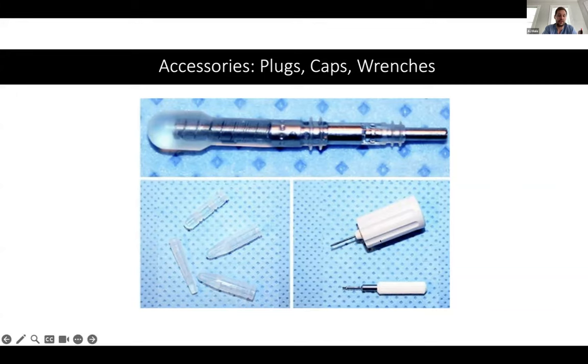And then obviously hex wrenches, always keep some extra hex wrenches ready to go. Reprocessed devices will not have hex wrenches waiting for you. So if you don't have one, you're going to have a can and no way to connect it. So I recommend always having these. I don't have it listed, but I always recommend having suture sleeves and medical adhesive as well. It is a great way to make a makeshift lead repair kit. If you're doing a generator change and there's damage to the lead, or you inadvertently nick the insulation, you can put glue around it, put the suture sleeve around it, and then tie it down with sutures. This is not a medical recommendation, but I have seen it function, I guess, is what I can tell you.